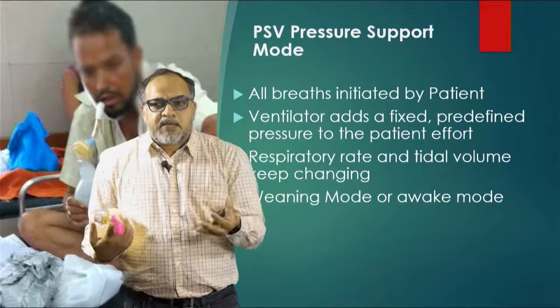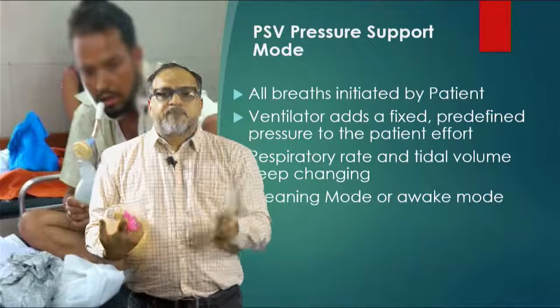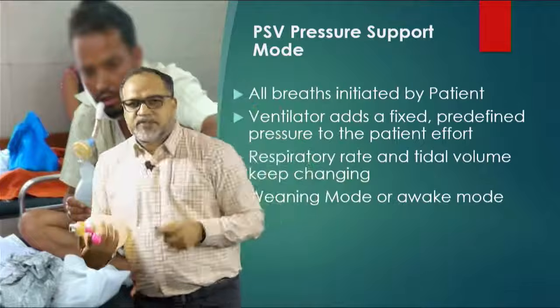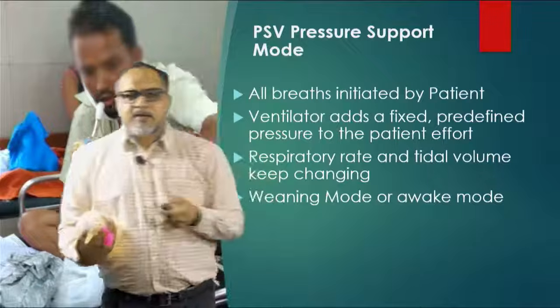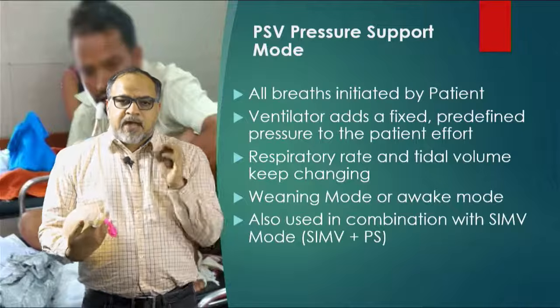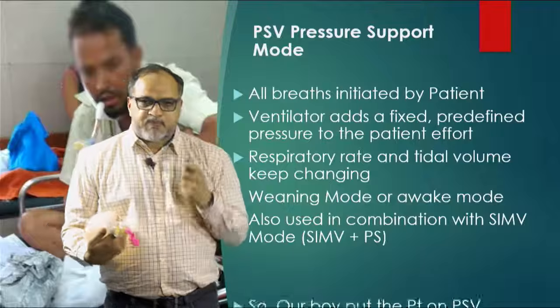If he is getting tachypneic, then maybe he needs more tidal volume. Again, we'll go to weaning some other day. Right now, it is just about differentiating the modes. So in PSV, all breaths are initiated by the patient. The ventilator adds 15 centimeters of water or whatever you set. The rate and tidal volume keep changing. It is a weaning mode, and it is also used in combination with SIMV mode.